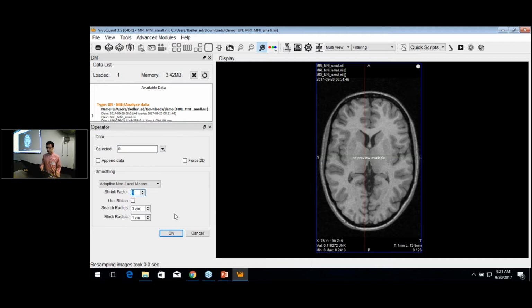Here, to get a nice quality, I'll just do it at the native resolution, append the results, and watch it run. Shouldn't be too slow.